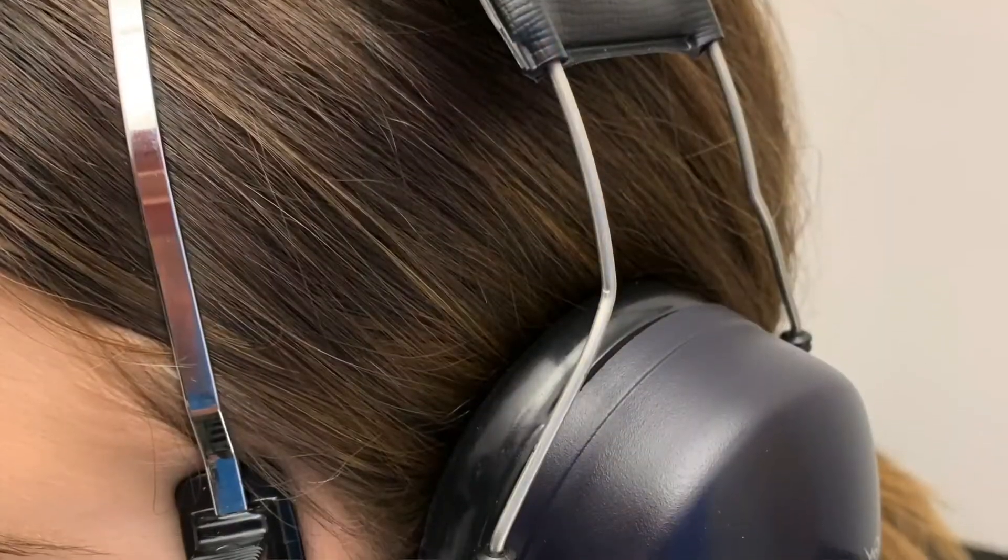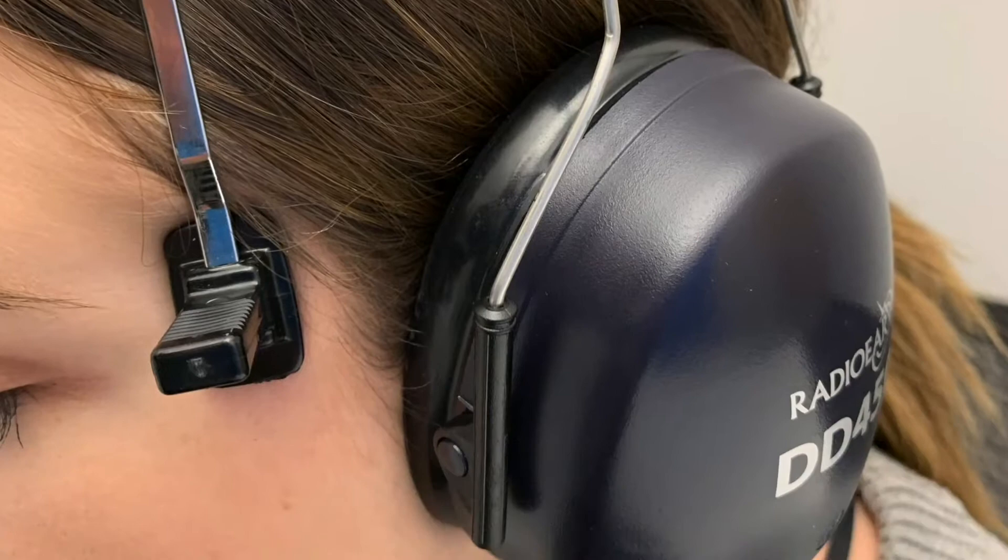It's important to make sure that there's no contact between the bone conductor and the air transducer, because you don't want to be vibrating your headphones at the same time. This setup is slightly awkward, so you'll want to be mindful to keep it on the patient for as little time as possible. Therefore, when you're finished testing, be sure to remove the equipment prior to doing any counseling with your patient or interpretation of the results.